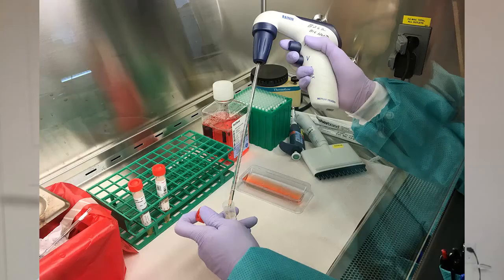The next step, once the specimen reaches the lab, is that the MLTs extract the viral RNA. The goal is that once the sample gets to the lab, you have to do a series of steps to really extract the RNA from the test tube. If you don't get this RNA, you won't be able to test for anything, because the RNA is the one you're going to be testing for in this sample.